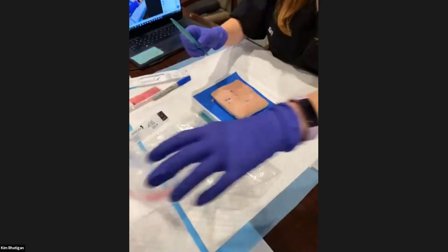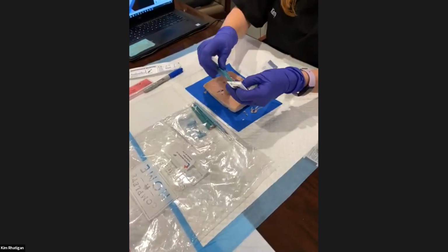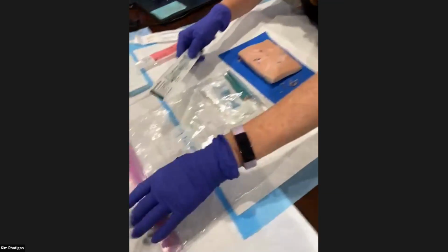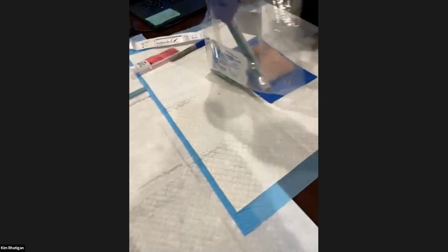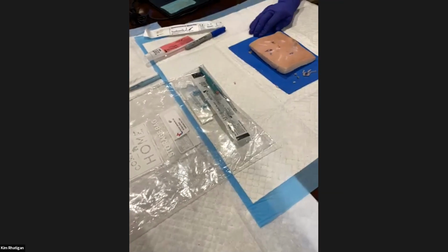I'm missing one sharp. Oh, my curette. Thank you, Dr. McClain. I could actually put this back in here too, just to be safe, since I don't have a sharps container here and they probably don't have one at home, but I put them all back in here just to be safe, and away from anybody else in your family.